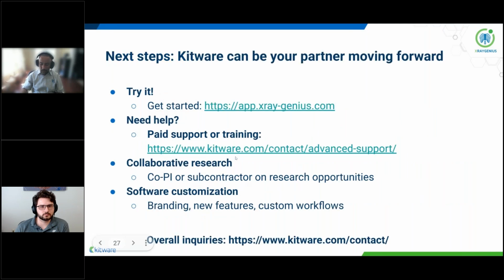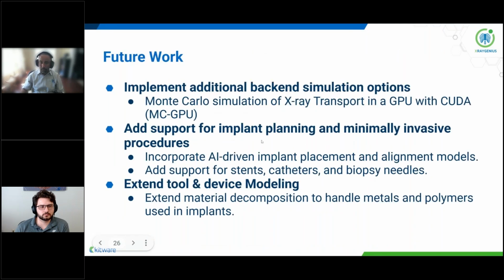Okay. So just to wrap up on the future work. These are the type of additional support that we plan to implement in the future. We haven't made any prioritization in terms of which ones we want to tackle first. So we would love to hear from you and potential users which particular features that you'd find to be useful for your research project. And that way, we will look at doing better prioritization.